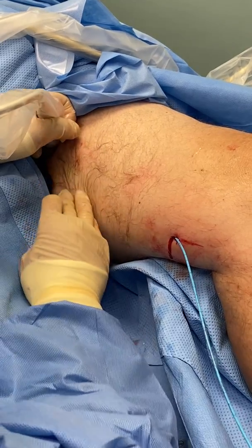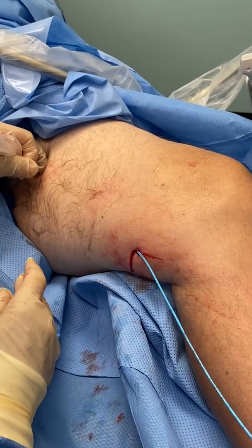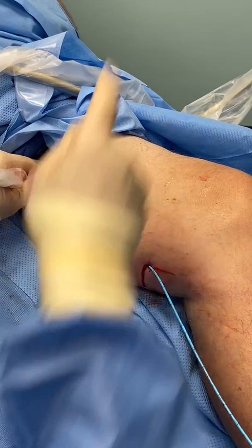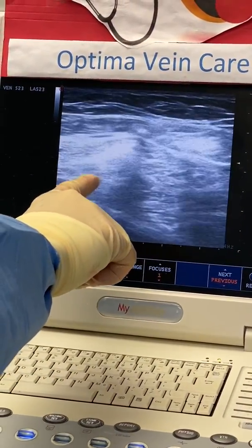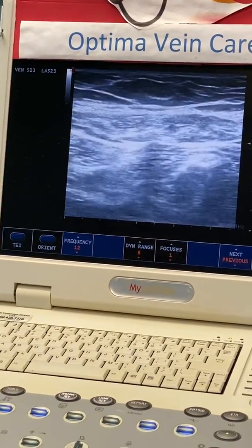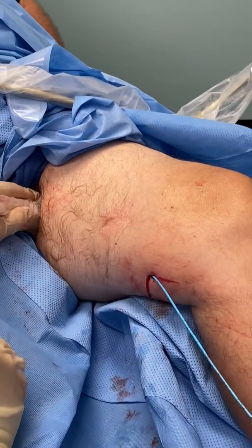Okay, so I'm going to release the pressure there. I'll go back and show you afterwards that the vein is already closed up here, but we're going to go down to our next segment. This is the vein right here on the screen — it's already closed up here. So we're going to go back down to find the proximal segment where the vein is still open a little bit. I want to make sure I keep my balance here. So we're right about there and I'm going to compress.